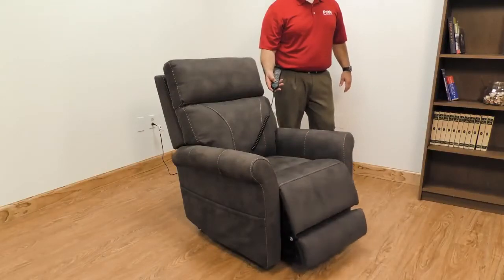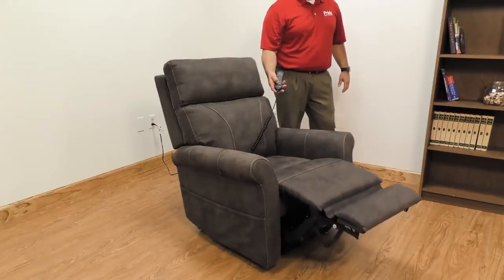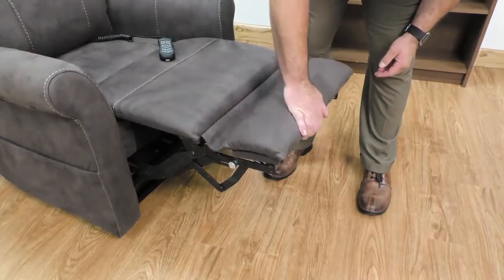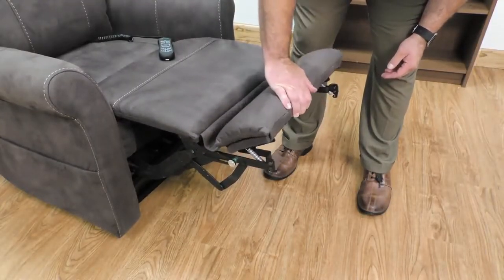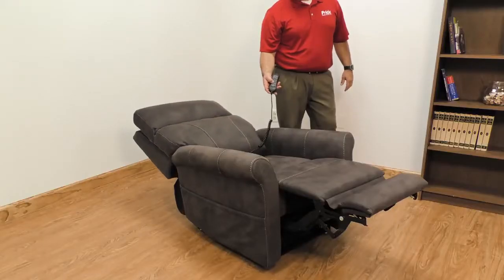The leg rest button operates the spring-loaded ottoman with footrest extension built in. The extension slides out with the mechanism to avoid any chance of getting caught on an obstruction. The backrest button operates the backrest all the way to the lay-flat position.